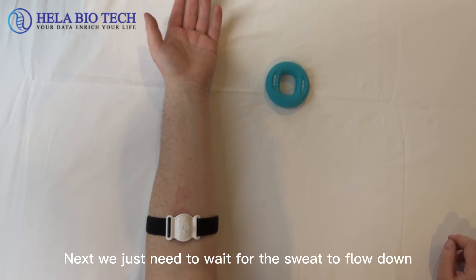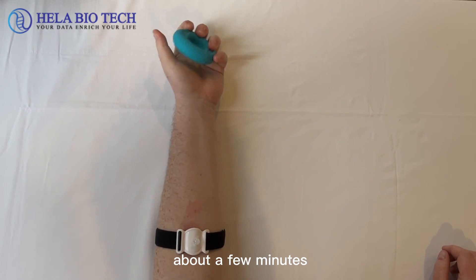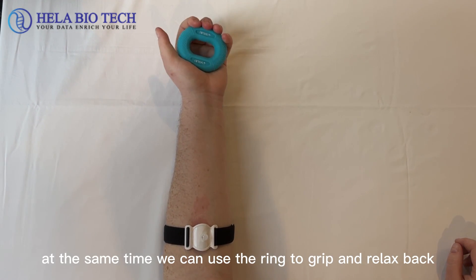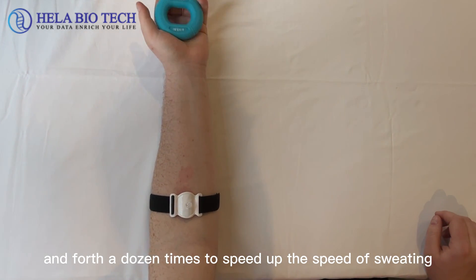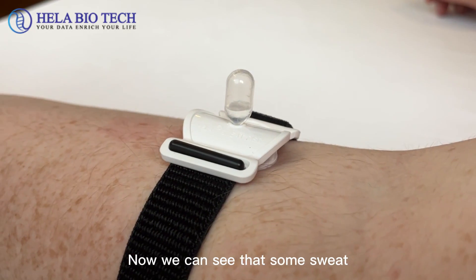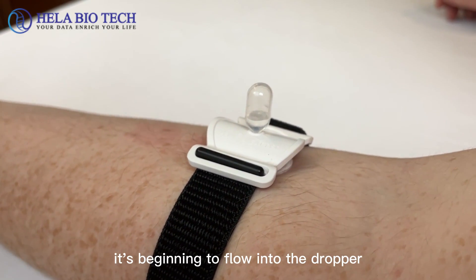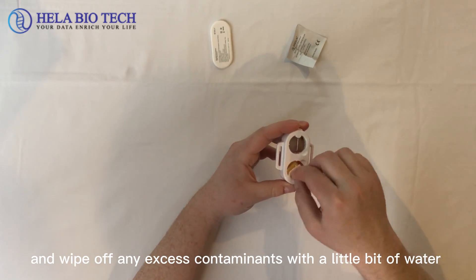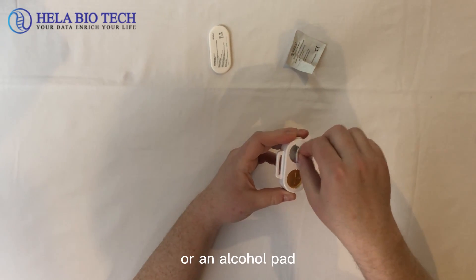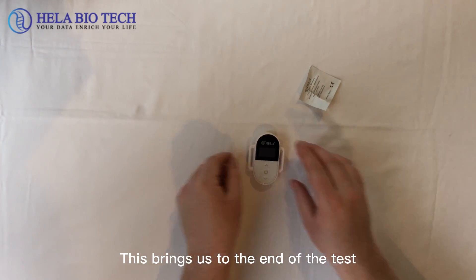Next, we just need to wait for the sweat to flow down. It does not take too long — about a few minutes. At the same time, we can use the ring to grip and relax back and forth a dozen times to speed up the speed of sweating. We can see that some sweat is beginning to flow into the dropper. Then, we need to clean the grooves of the sweat inducer and wipe off any excess contaminants with a little bit of water or an alcohol pad. This brings us to the end of the test.